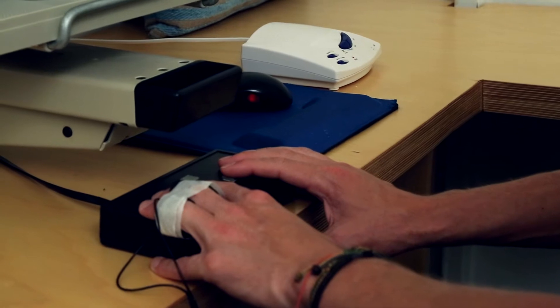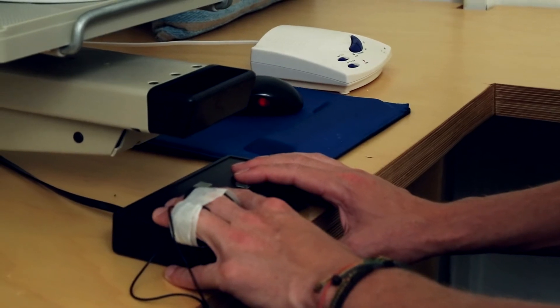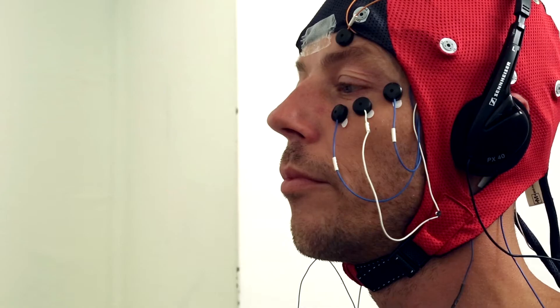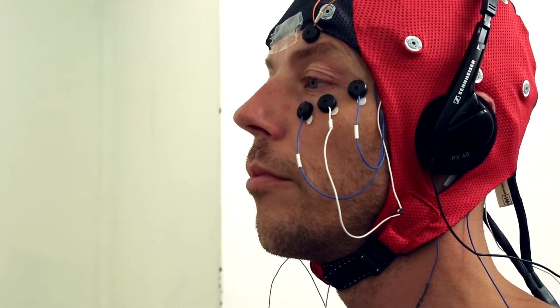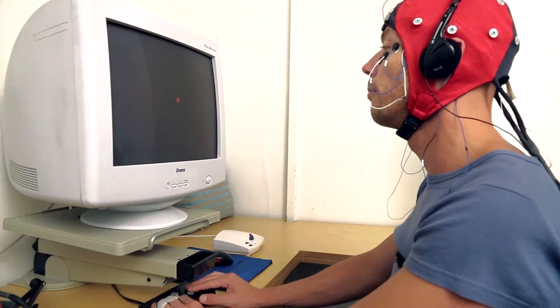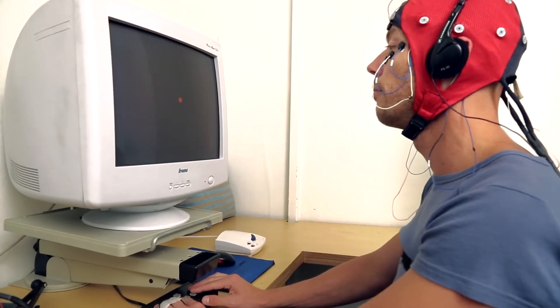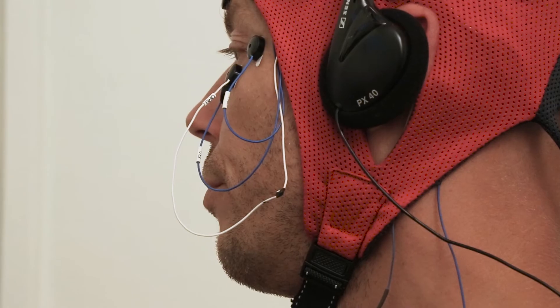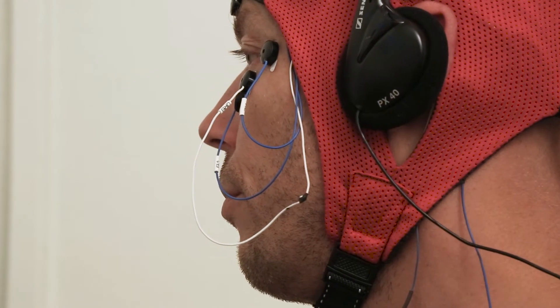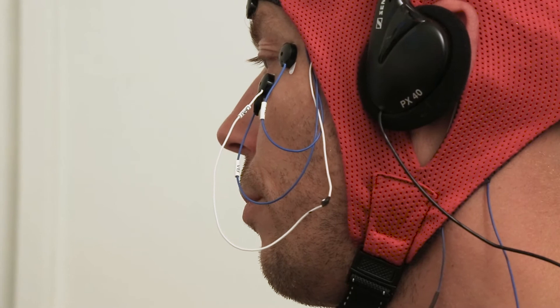The EEG, or electroencephalogram, is an assessment of brain activity. During the QEEG, quantitative EEG, the client performs a number of tests.